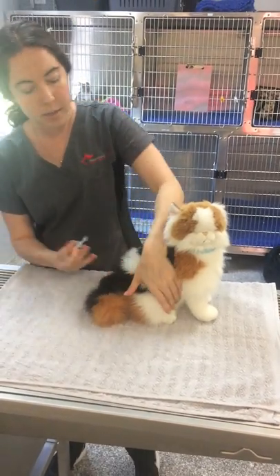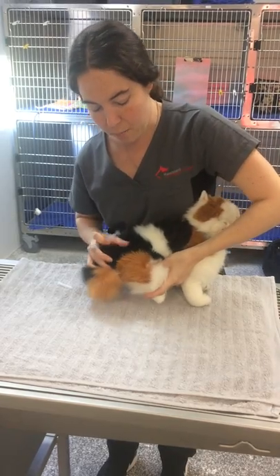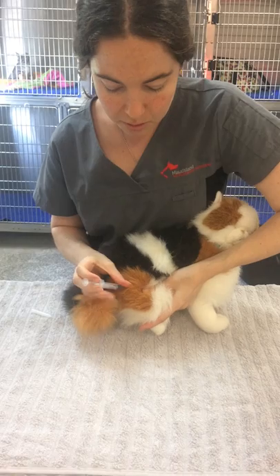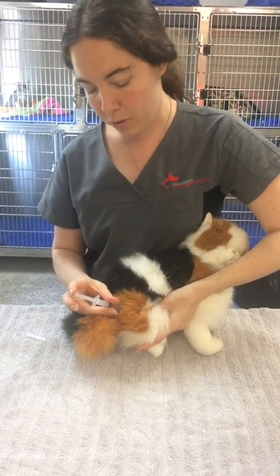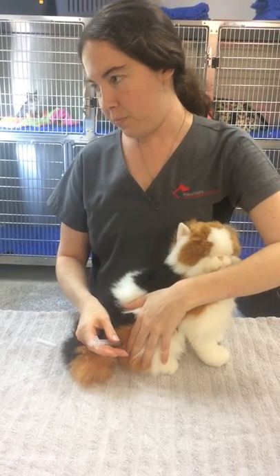With the hind leg it's best if you get underneath it and locate the muscle and push it up towards you. Once you've found it, you can put the needle in, draw back on the syringe to make sure it's in the correct spot, and then you can give the injection.